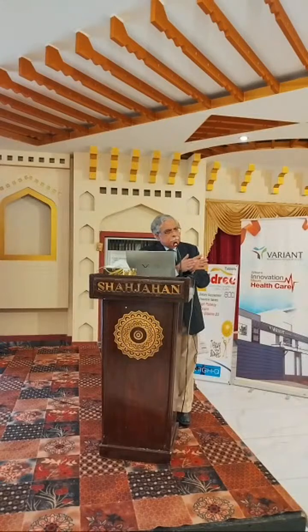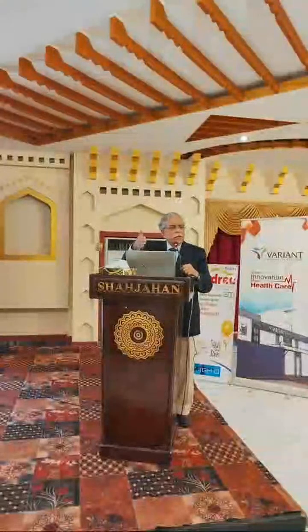And so this is a way of doing uterine artery Doppler when you're looking at the paracervical region. Okay, so you can see this. You can start in the middle. Without sliding your probe, you simply tilt your probe, turn on your Doppler, and you have this very big vessel going inside the uterus. And that is the uterine artery.